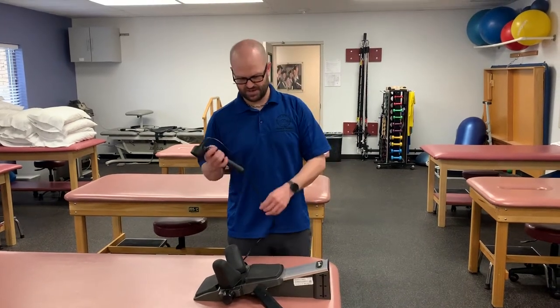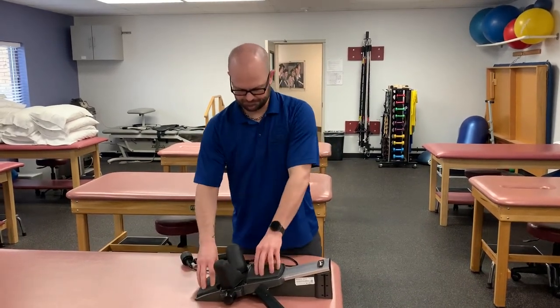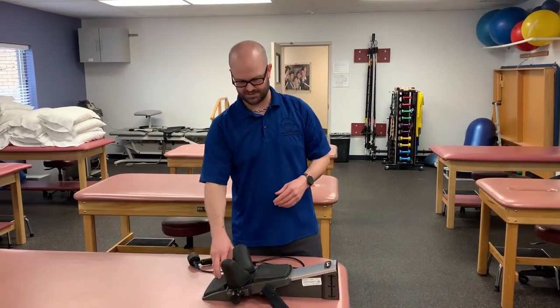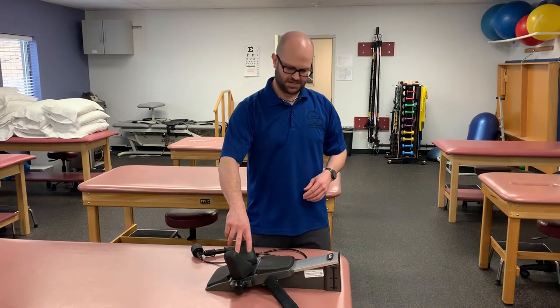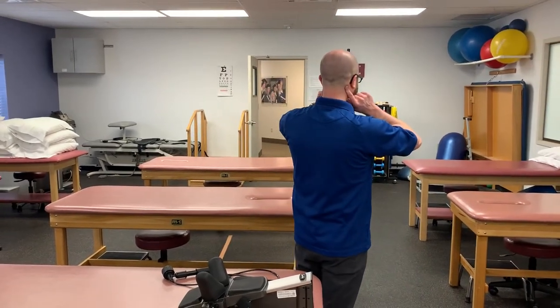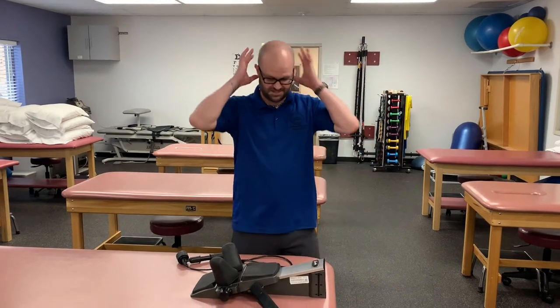Just a few things about the machine. We've got some nice little cushions — this one is just to rest their head on, and this one is to support the neck a little bit more. These will actually sit right here on the patient and are what cause that traction.